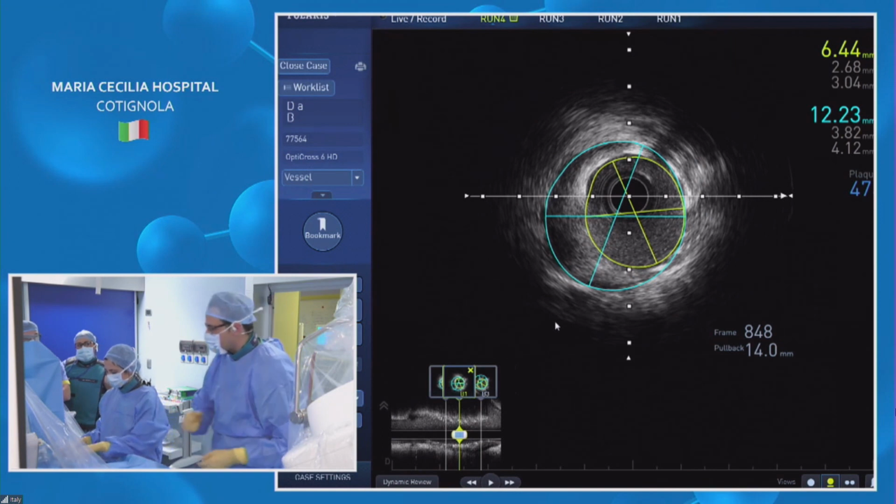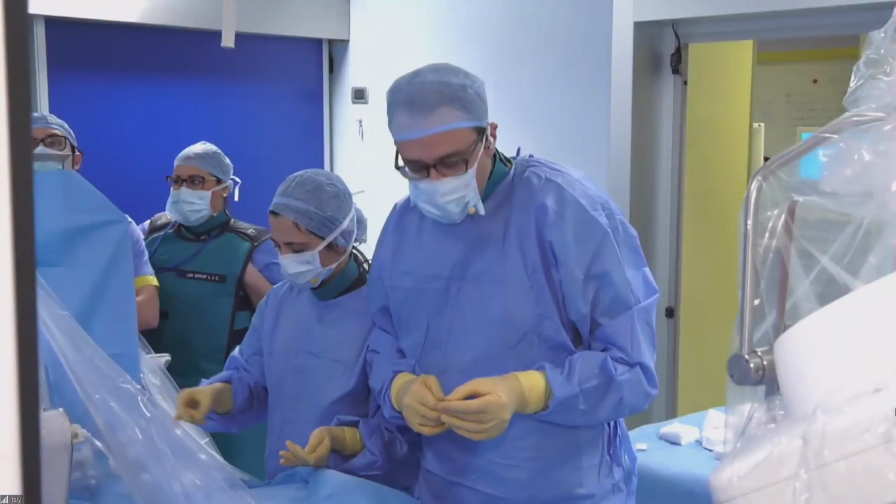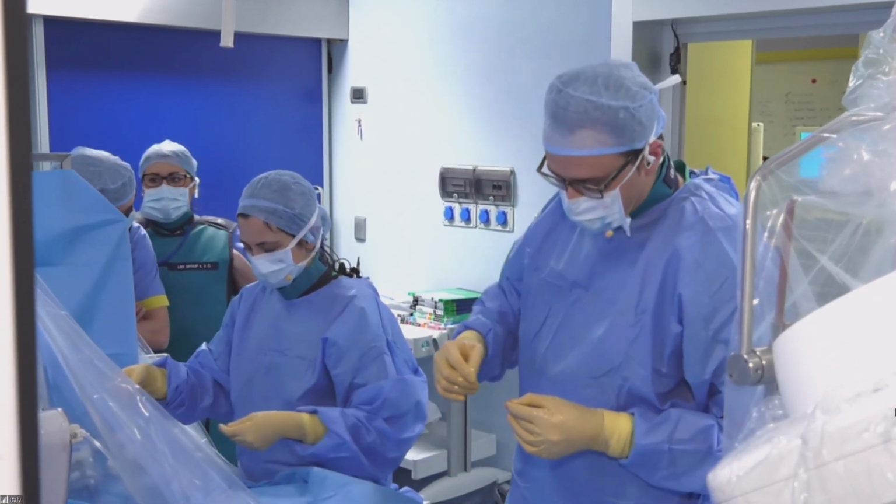24 atmospheres, and let's do the highest to see the final check. Yeah. Okay. Perfect. So maybe in the meantime, we can switch to the other lab, see what Antonio is doing.